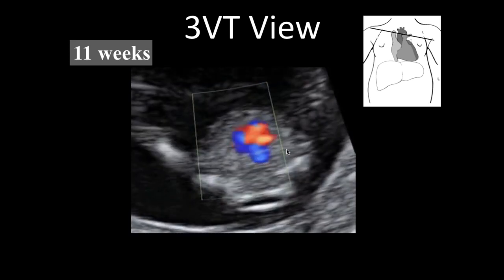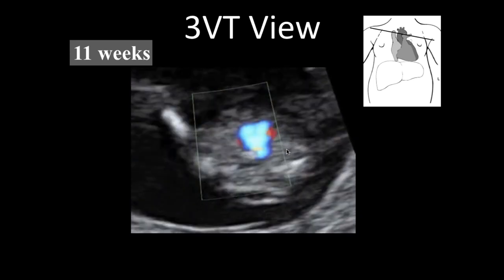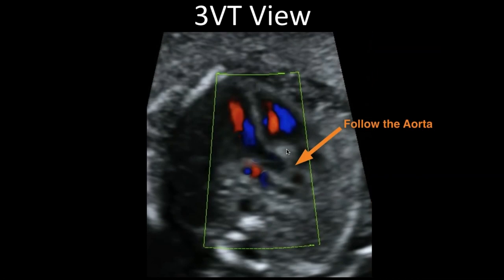Looking at this fetus at 11 weeks, I could tell you that I'm reassured that there are 2 great vessels that are equal in size and have forward flow in them. So I've ruled out a lot of conotruncal anomalies that can be of serious consequences.